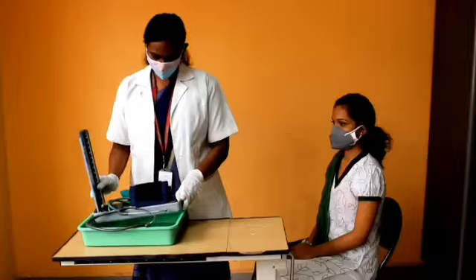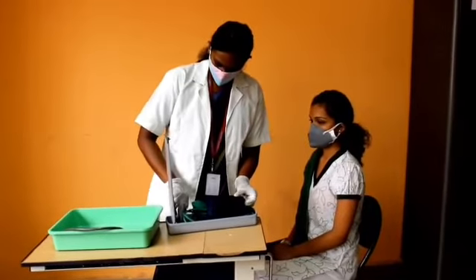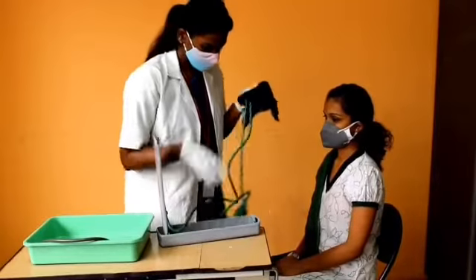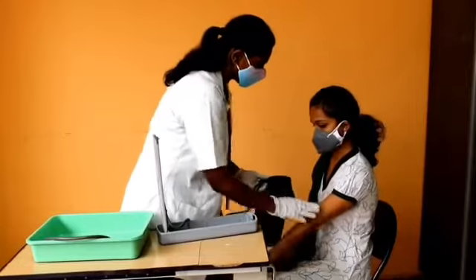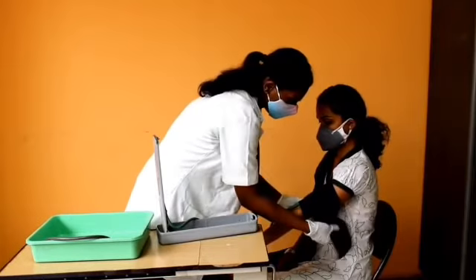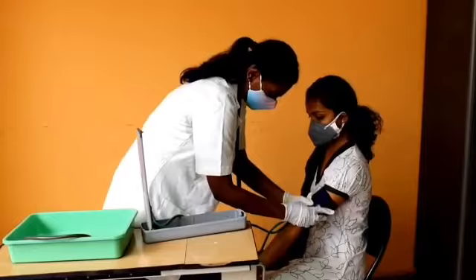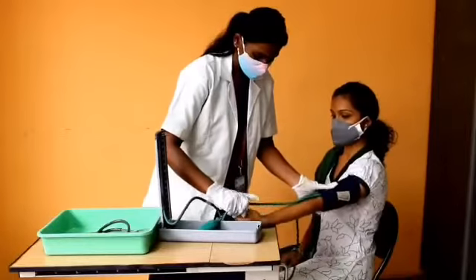For blood pressure, we need a BP apparatus and stethoscope. We should wear gloves after medical hand washing. First, tie the cuff two to three inches above the antecubital fossa. The patient's hand must be at heart level.